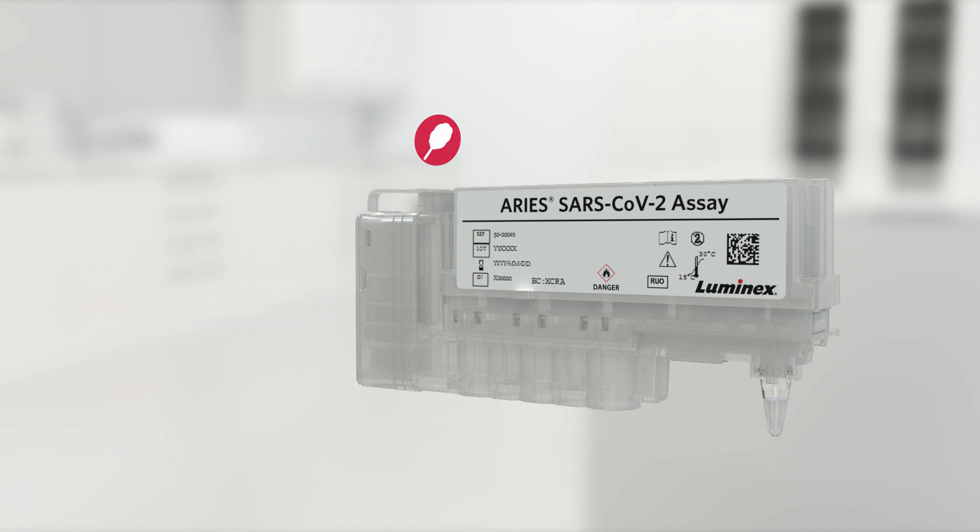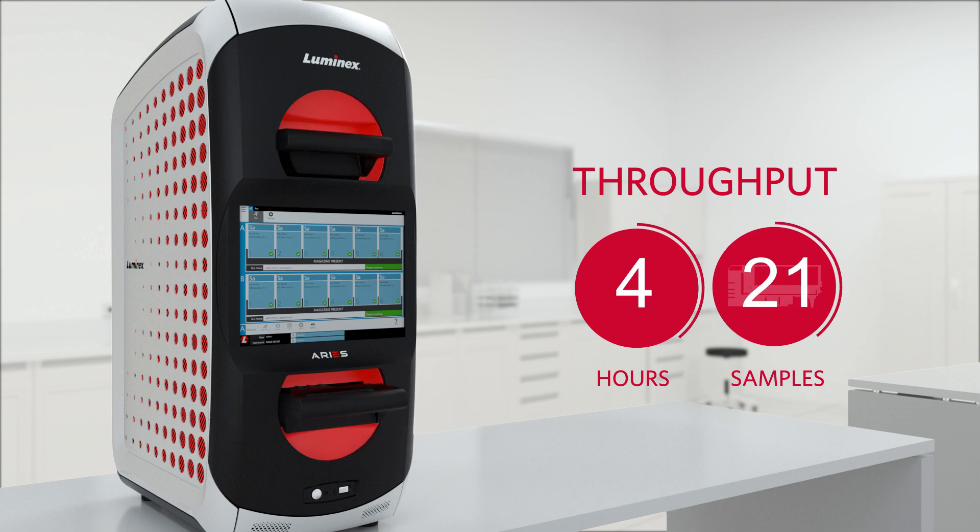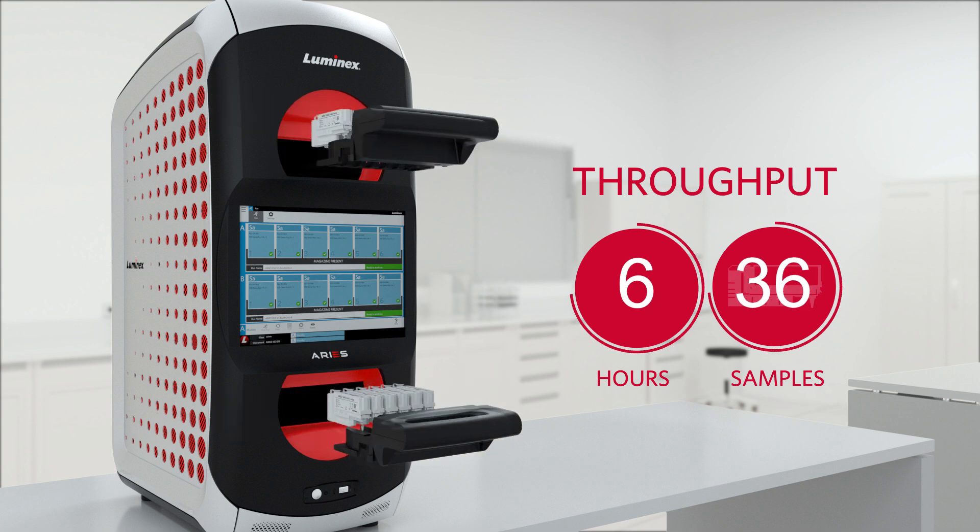The PCR reagents and primers are located at that end. The time to result is 2 hours for up to 12 samples, and as many as 48 samples can be run on a single instrument in an 8-hour shift.